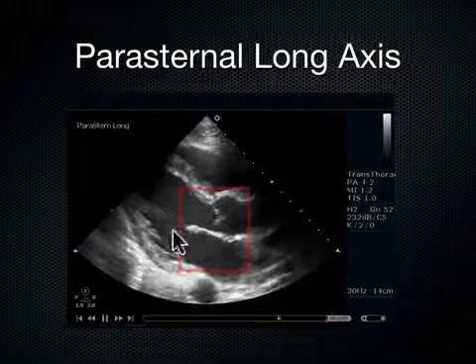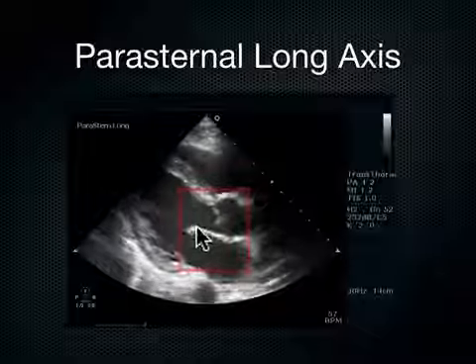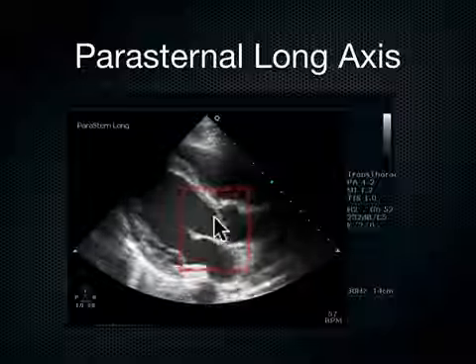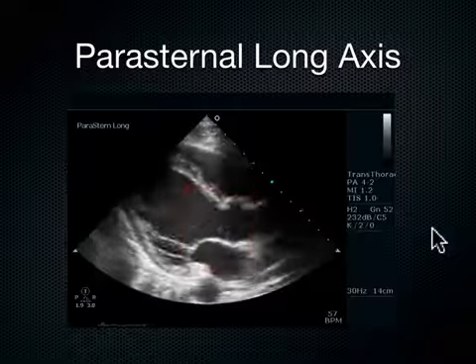Now I'm going to focus on this area right here first, and I'm going to see how well that septal leaflet comes up and smacks that septum. If it does, great, which it's doing. Good. And the sequentiality between the mitral valve and the aortic valve. Do they fire at the same time, or is it sequential? I see some pretty good sequentiality there.